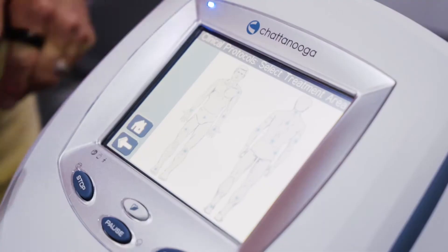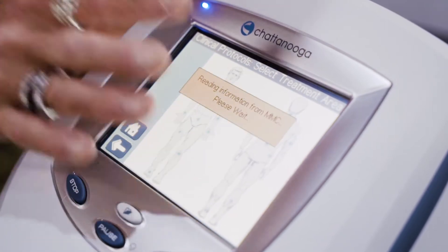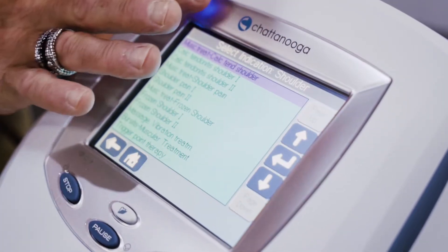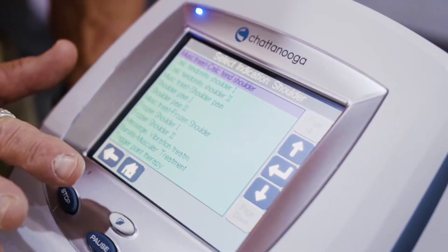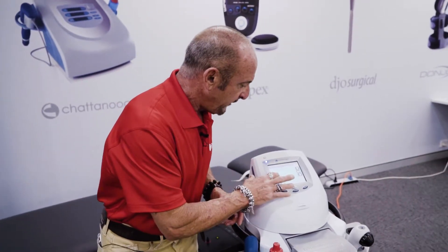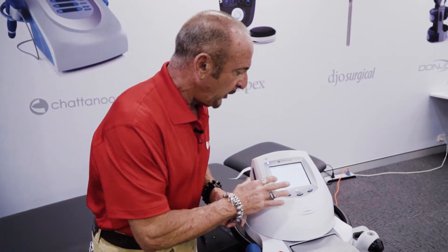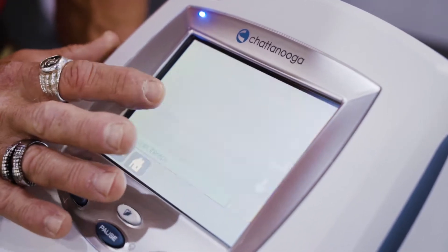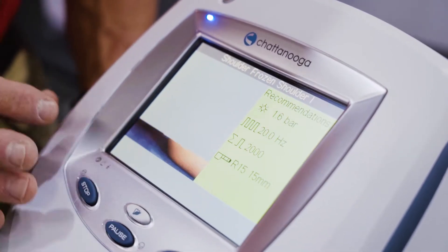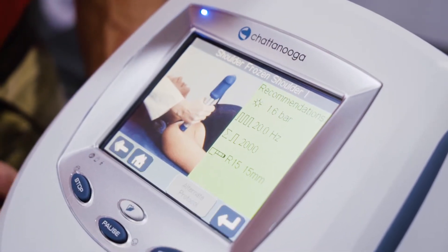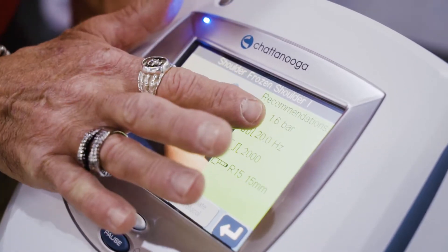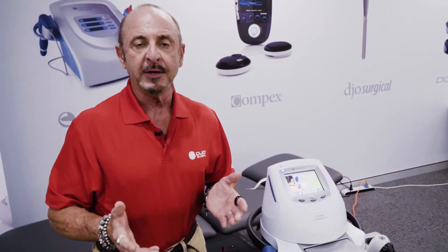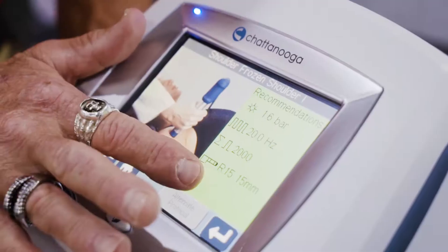If I click on the shoulder, I get ten more deeper diagnoses closer to what I want, and frozen shoulder is right there. I click on my frozen shoulder protocol — it gives me the recommended energy, how many shocks I'm going to deliver, my frequency, and even a recommendation for the transmitter.